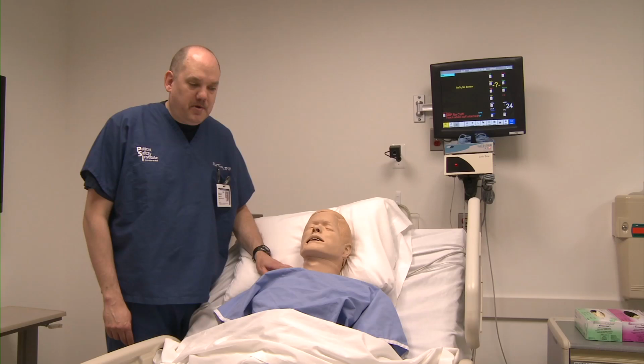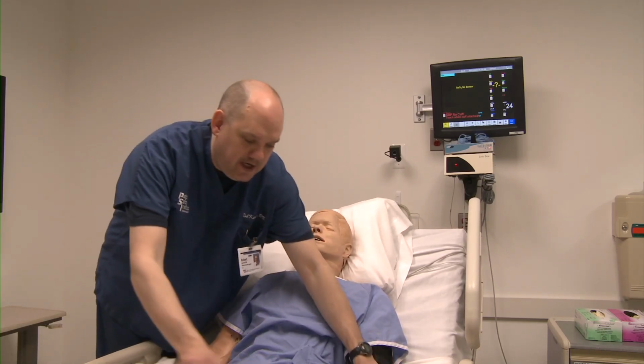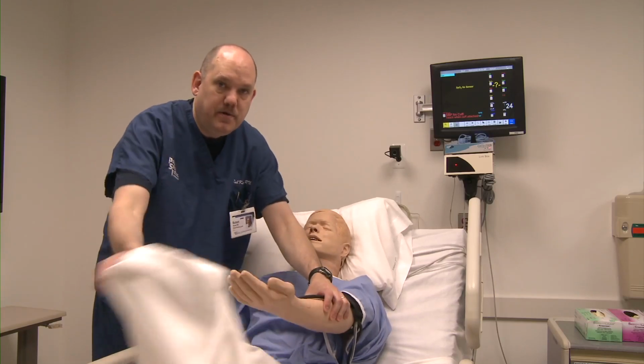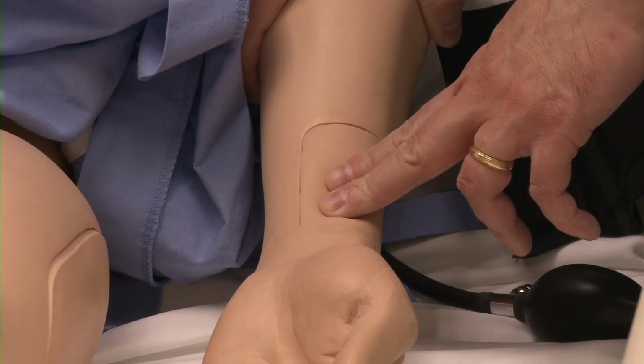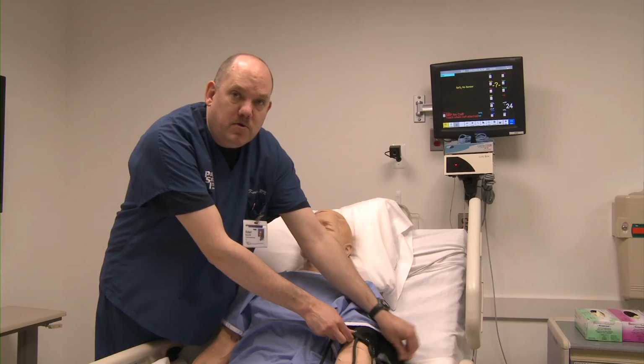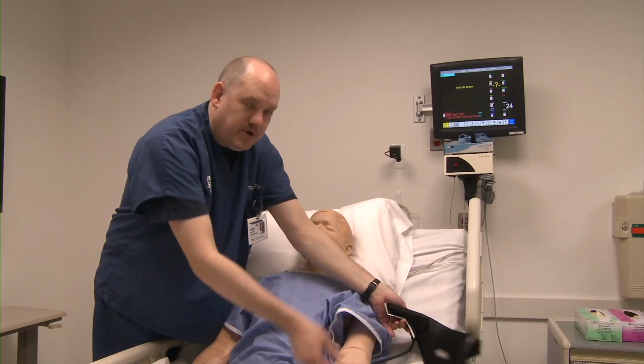You may also assess the pulses on the left arm. The left arm contains a radial pulse, where you would normally expect to find it, and a brachial pulse, which is ordinarily concealed underneath the blood pressure cuff.